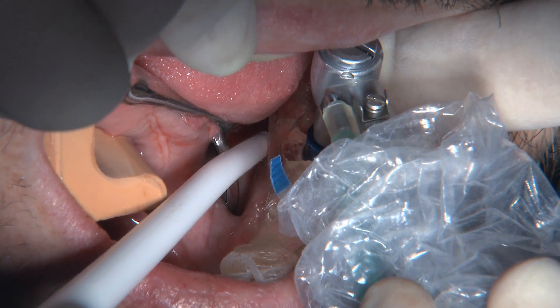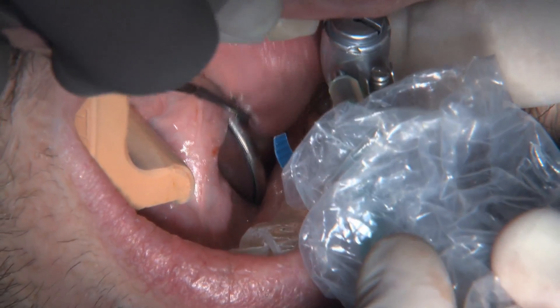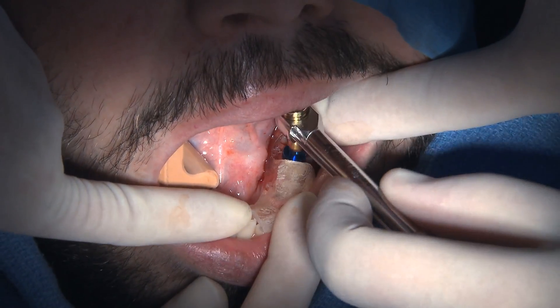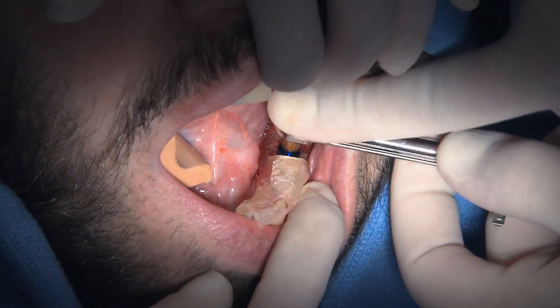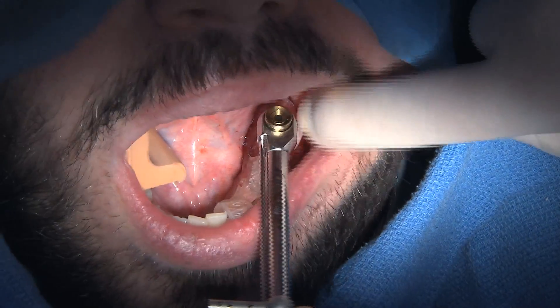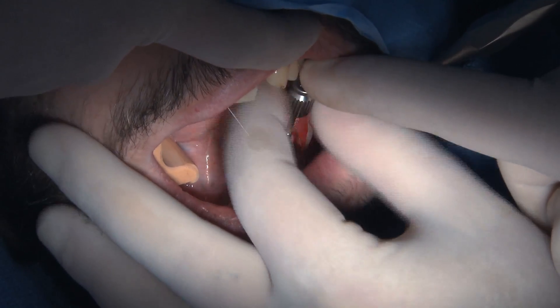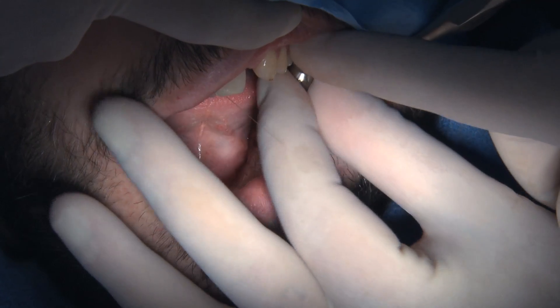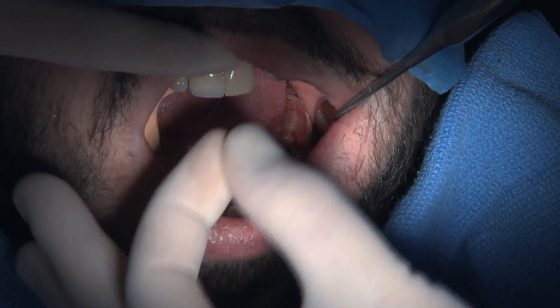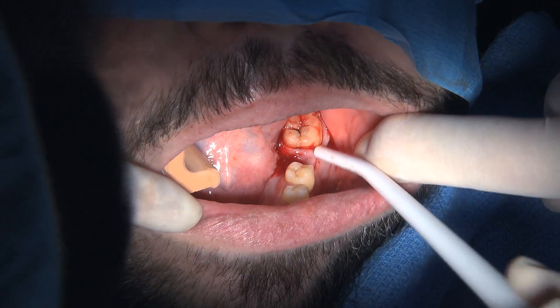We're going to stop a couple turns from it being completely seated and use a torque wrench to seat the implant those final turns instead of the handpiece. The mount is still present on the implant, attaching it to the handpiece and to the torque wrench. I do the last few turns by hand, and as the torque wrench starts to feel resistance, you can see it tap out — that's the sign the implant is down all the way. Then we use a hand wrench to unscrew the mount from the top of the implant.